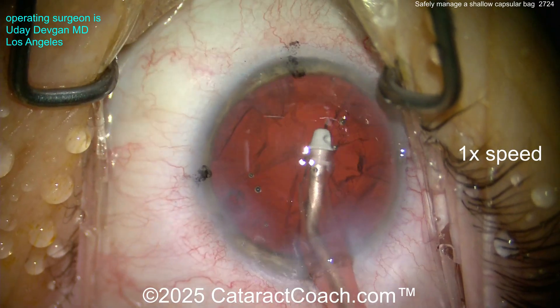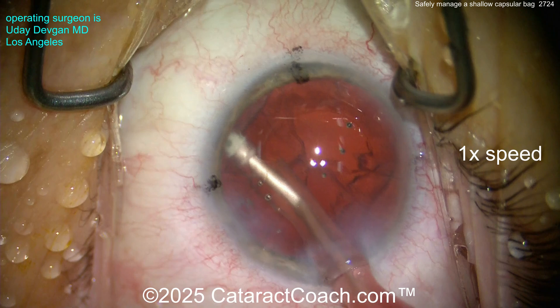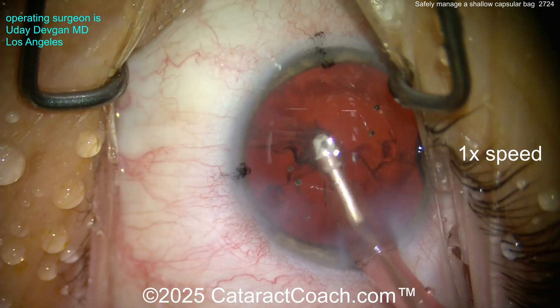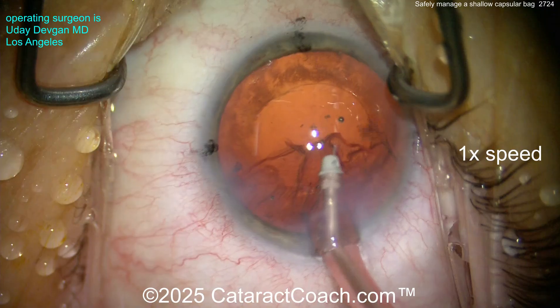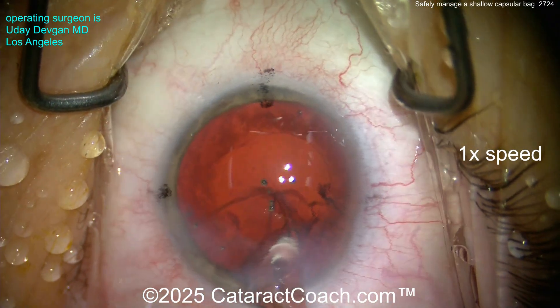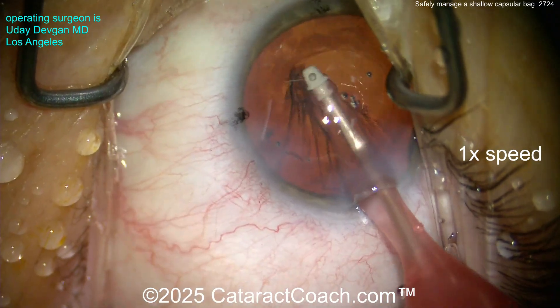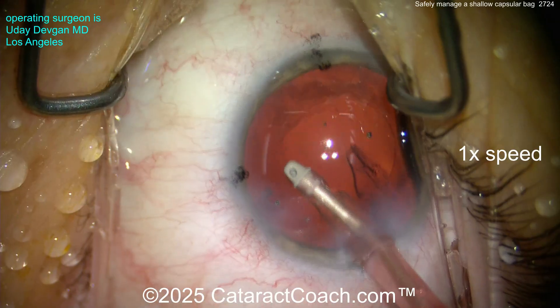This is not a 3D video, but you can certainly tell — the bag is a little shallow. We've all had those cases where you're doing cataract surgery and you think, the bag seems kind of shallow. You can increase the infusion pressure right now — increase your IOP, or if you're using an older machine, increase your bottle height — to get a little bit deeper anterior chamber and deeper bag.